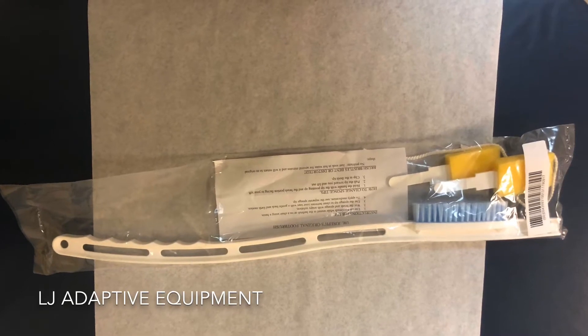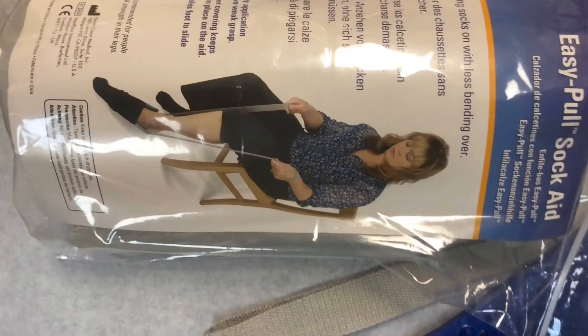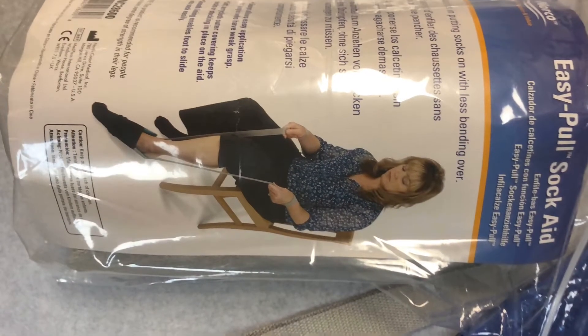The first adaptive equipment is the original foot brush, shown here with the long handle for easy use. The second one we have is the easy pull sock aid.